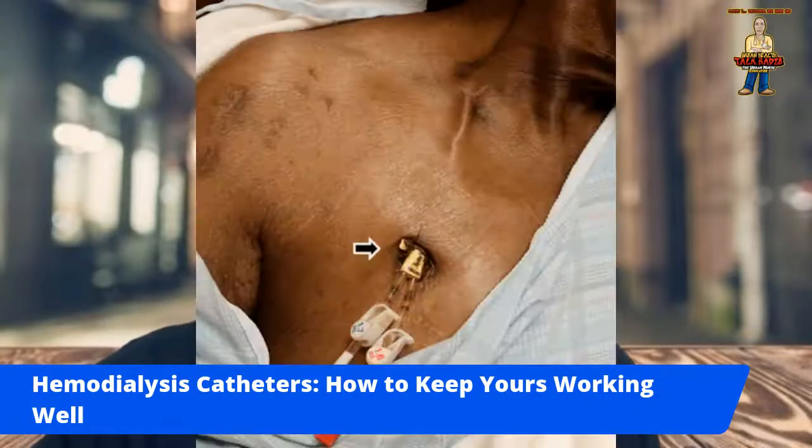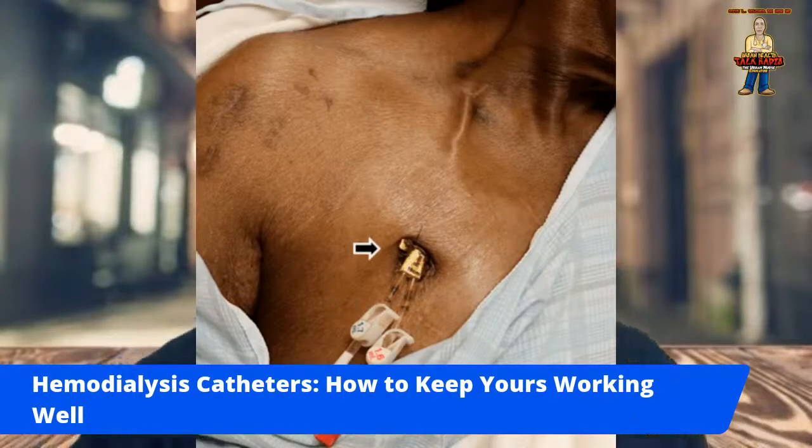So, right here, make sure the area of the insertion site, and you see where that arrow is pointing, you've got to make sure that area is clean and that the care team changes the dressing at each dialysis session.